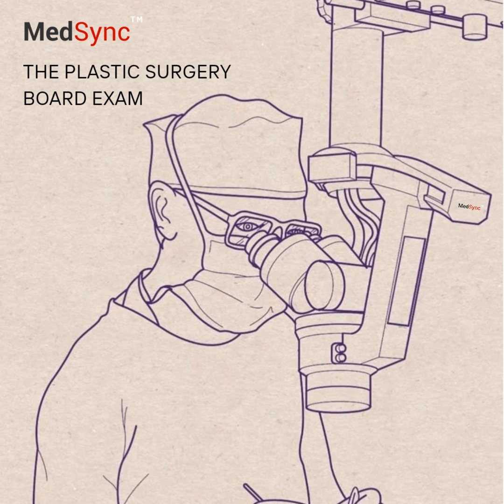What about grafting over exposed bone, say on the skull? Yeah, that's tough. Sometimes drilling small holes into the outer table of the bone, like the cranial diploe, to get pinpoint bleeding can encourage granulation tissue formation. Then NPWT can help nurture that granulation bed before you attempt grafting.